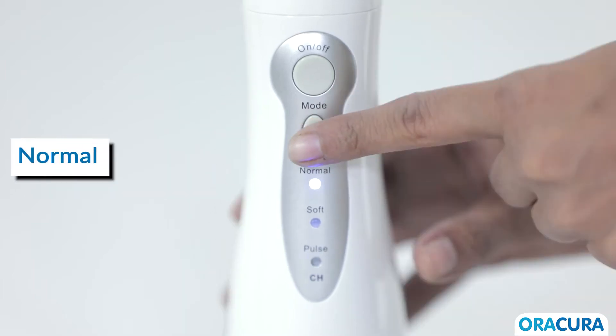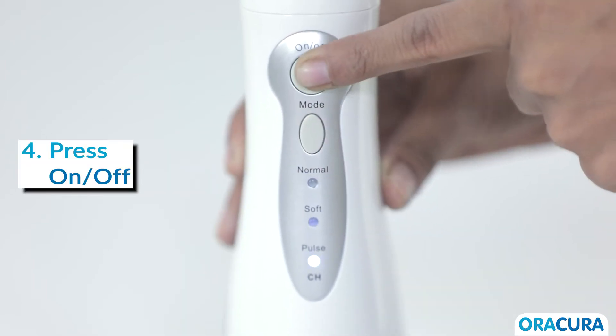Step 3: Select the mode — Normal, Soft, or Pulse. Step 4: Press the on and off key to start.